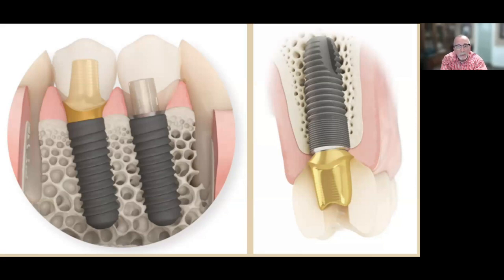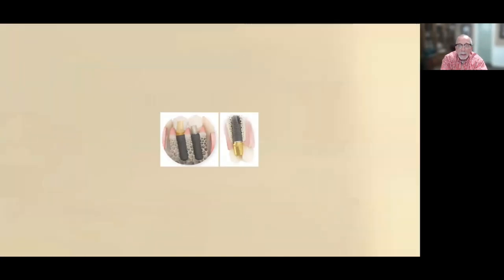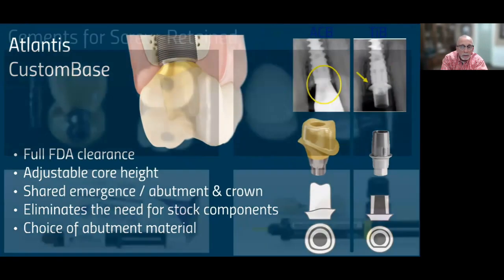I mean, we have to deal with those things. And having the ability to customize everything from that interface up and give the crown the support it needs is really the only way I would want a single tooth implant in my head. So that's my favorite way of doing it.